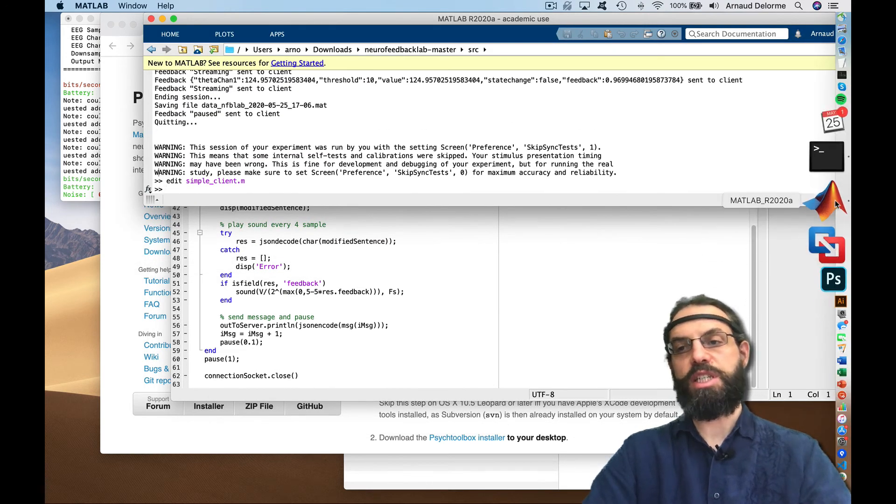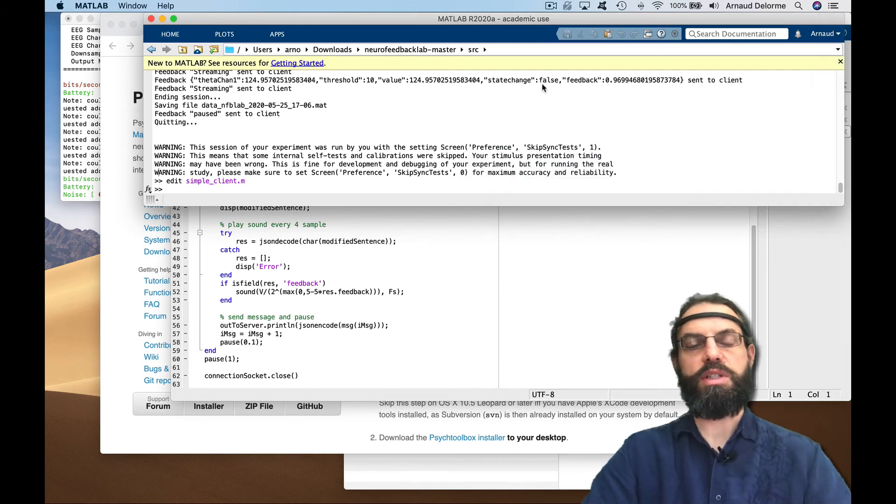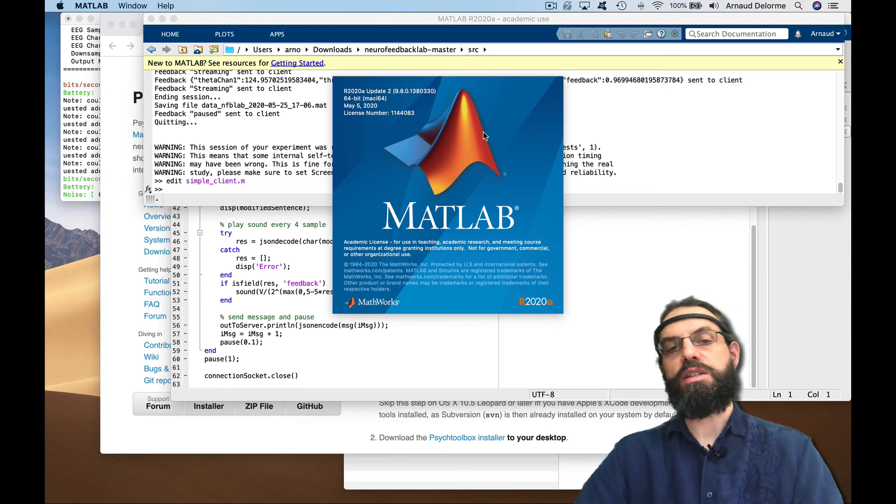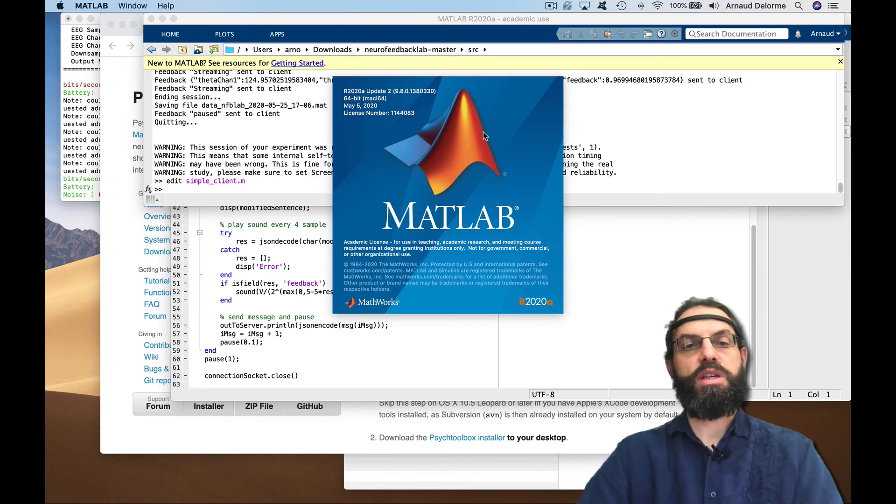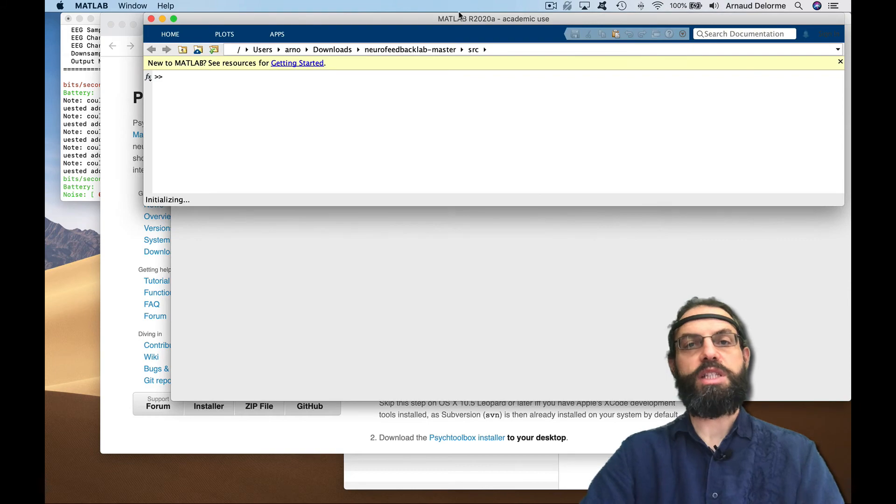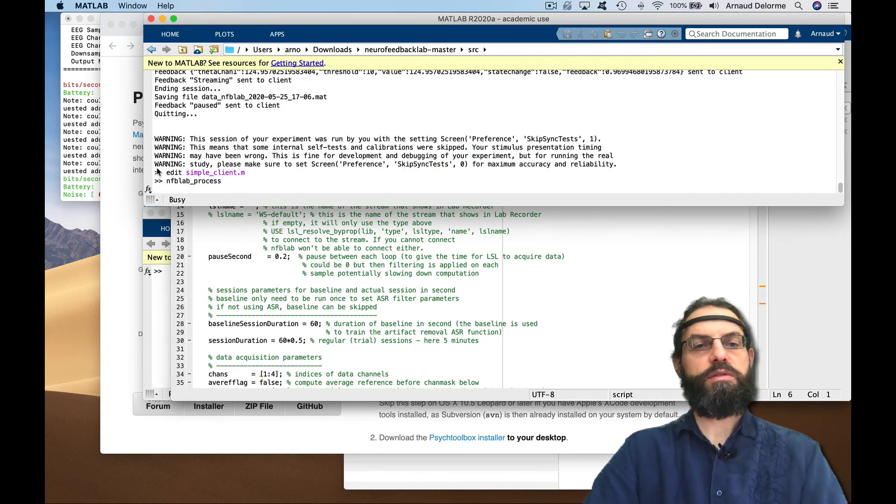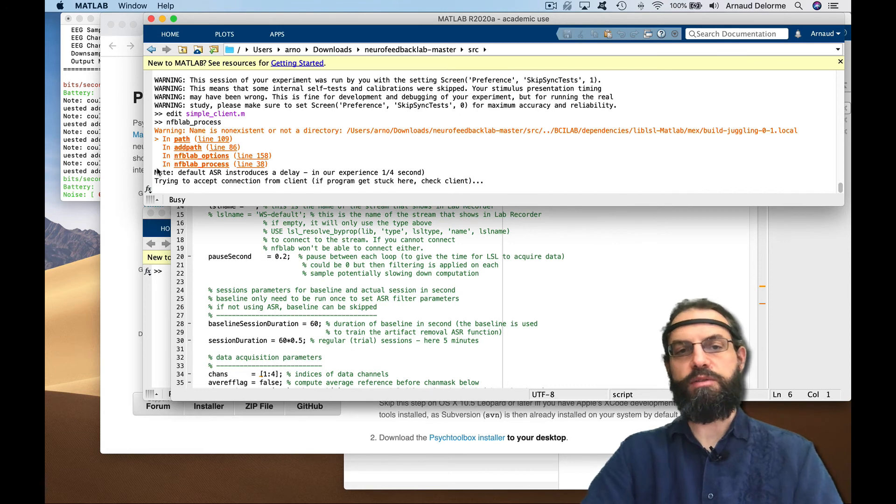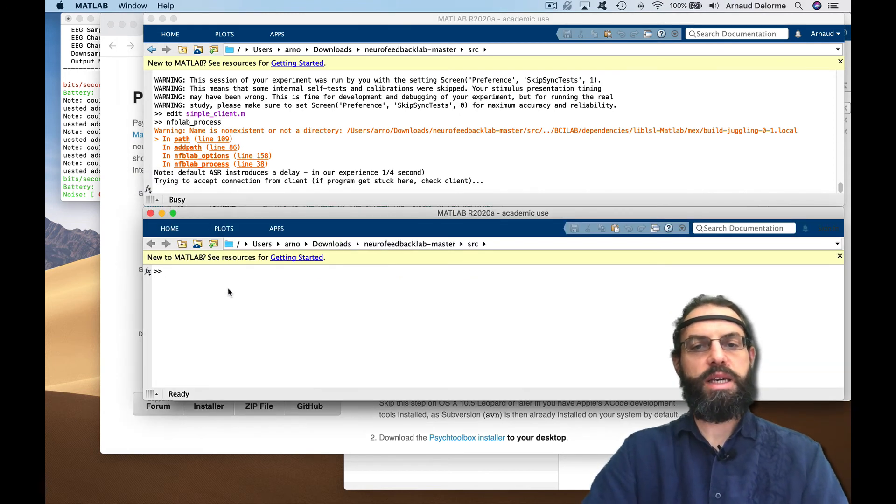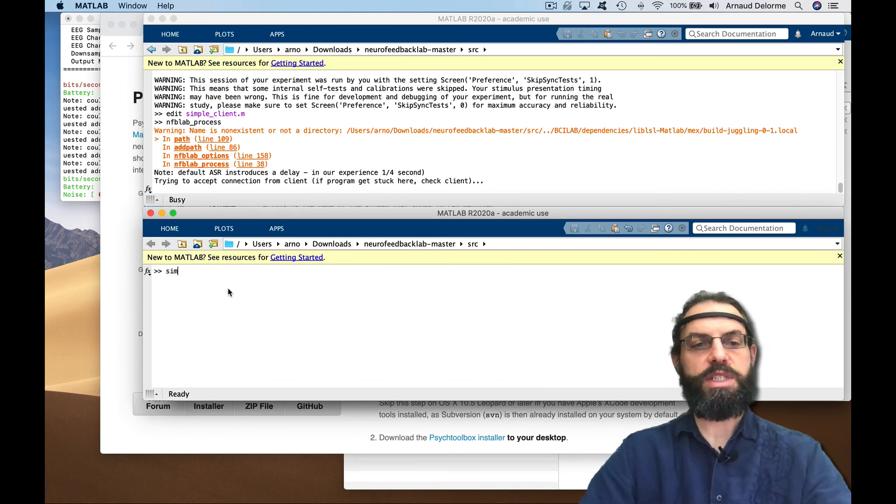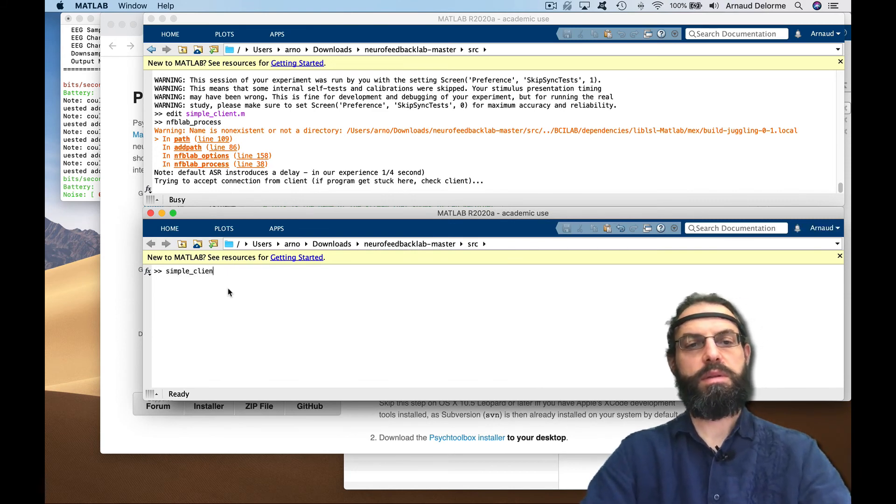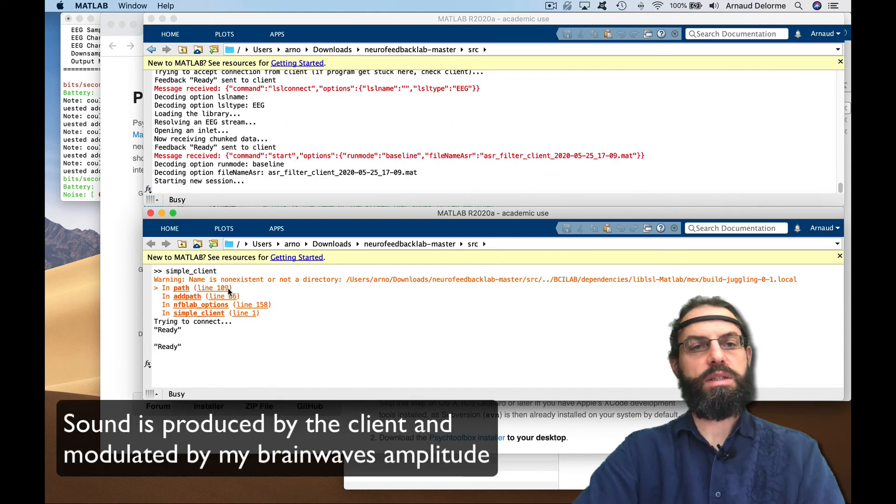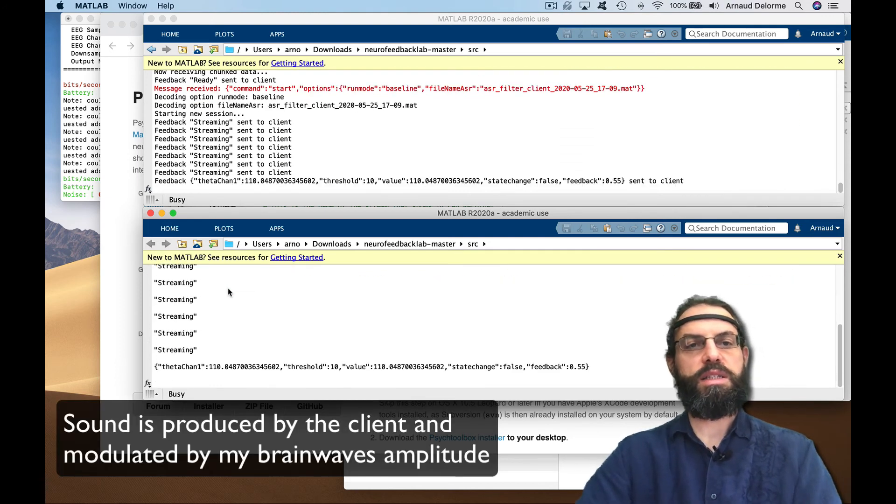Let's try it out. For this I would need two MATLAB sessions, so here I'm going to open an additional instance of MATLAB. Again, the client here is in MATLAB but could be in any other language as long as it's TCP IP communication. Neurofeedback lab process, so now it's waiting for somebody to connect to it. I'm going to run this program, simple client. Okay, it's connecting, connected to the headset.